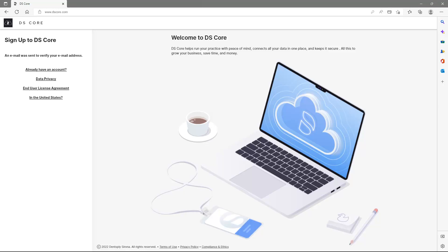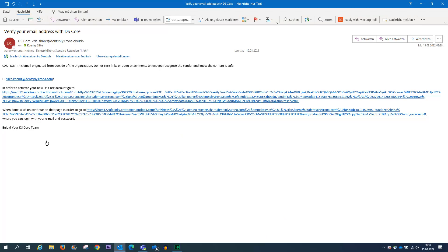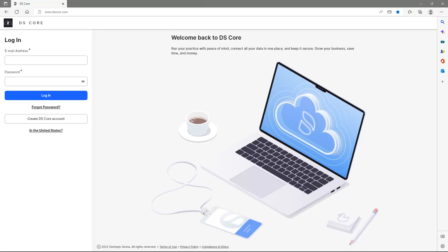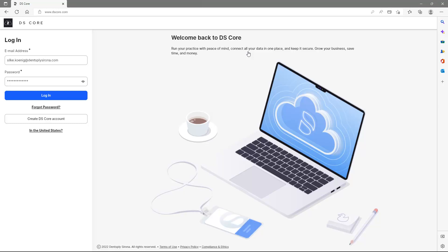Next, we will open our email inbox in order to verify the email address. To activate the account, we tap on the first link and receive the confirmation that the email has been verified. By tapping Continue, we can now log into the account. After entering the login details, we confirm with Login.